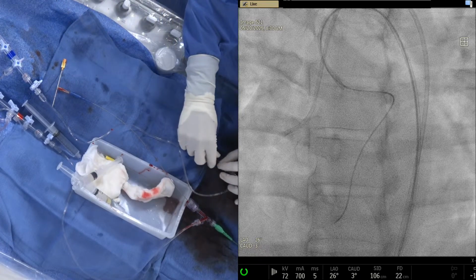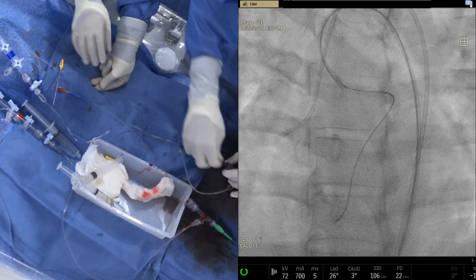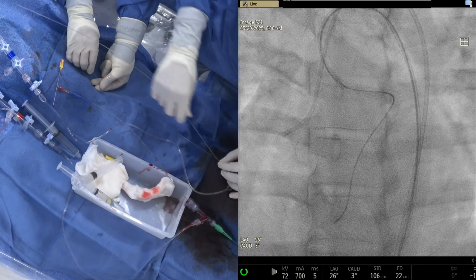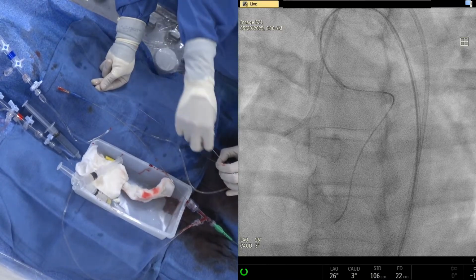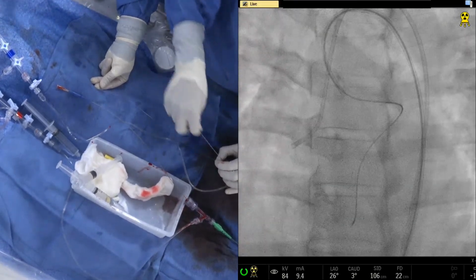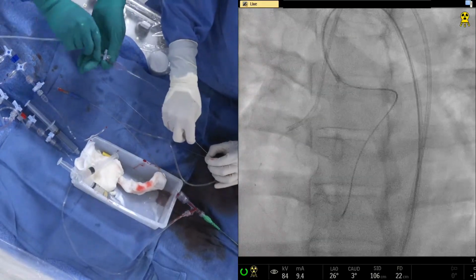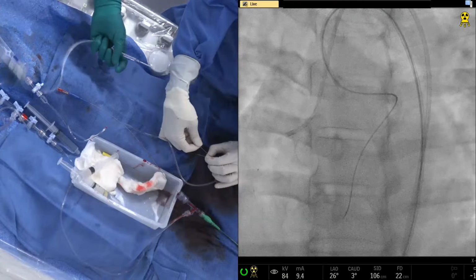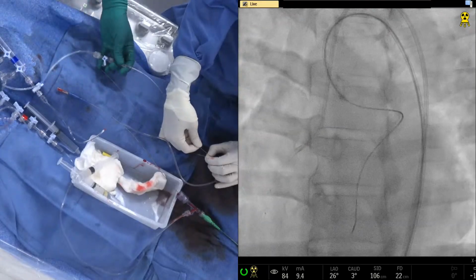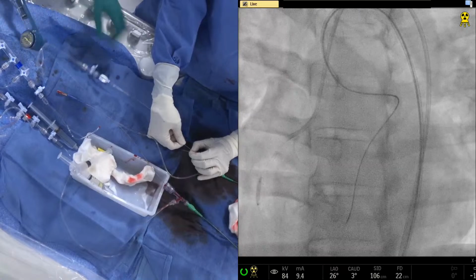You see the wire came out, and we are going to cut the tip of the wire, which is floppy, and then advance the balloon. Not 300, 150 run through. Yes, you can take a run through now, antegrade. Okay, good. Dilate here. Once you have dilated and we antegrade run through, we can remove this later. Okay, good.